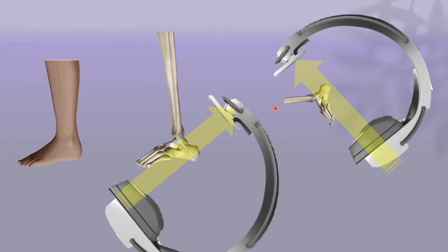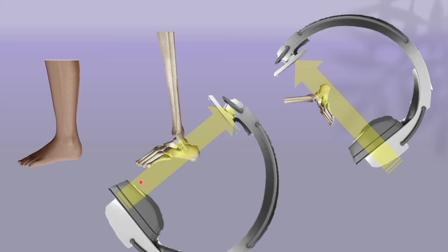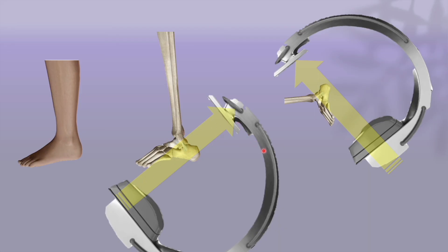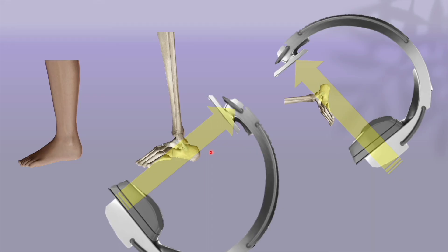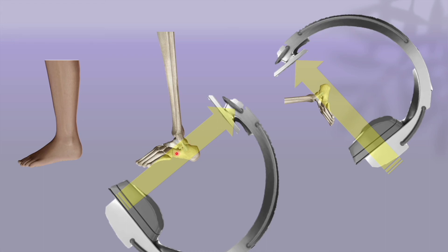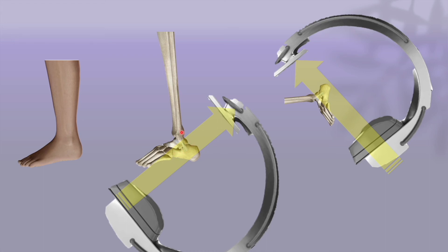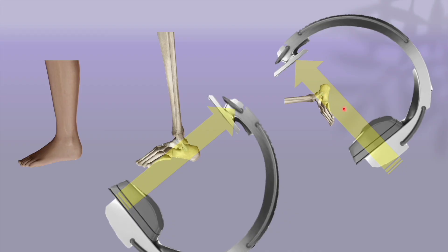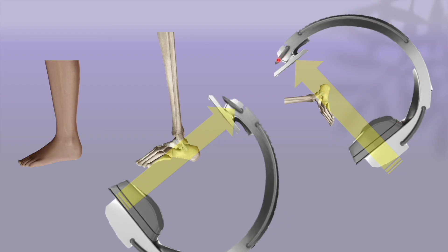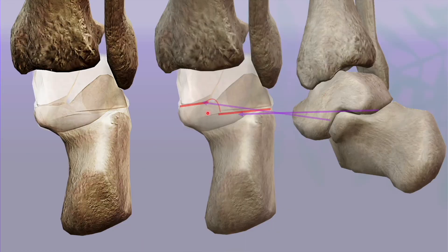Now I'll show you the technique for getting a good axial view in lateral position. The fluoroscopic beam needs to be parallel to the posterior facet. You position your C-arm like a lateral view at the foot end and rotate it so that the fluoroscopic beam passes parallel to the posterior facet. Alternatively, you can keep the limb in prone position and get an axial view by rotating the console until you are parallel to the posterior facet, at which point you will be able to see the posterior facet orthogonal to the fluoroscopic beam.